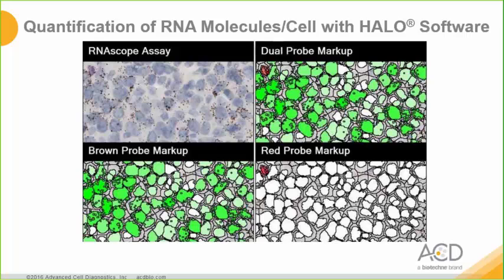The cells with slightly darker green nuclei have 4 to 9 dots. You can see that the software has identified the lone red cell with red dots. If there had been any cells of co-expression, the nuclei would have been highlighted with yellow or brown.